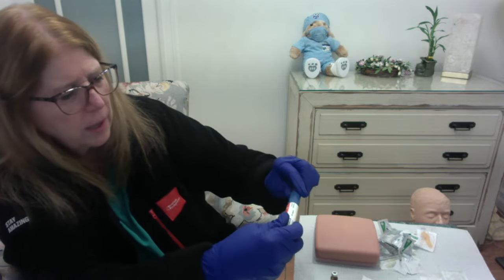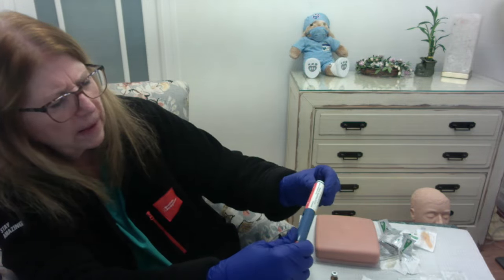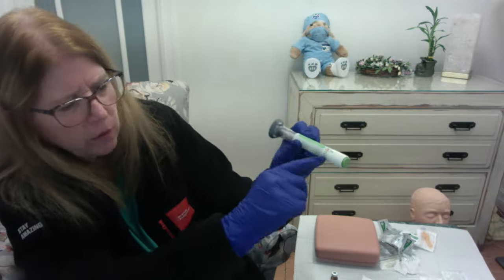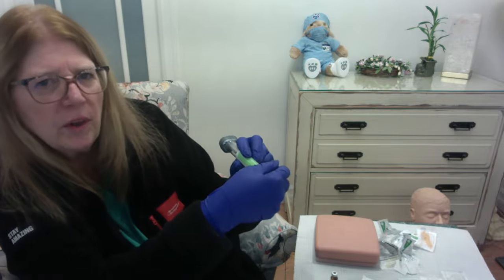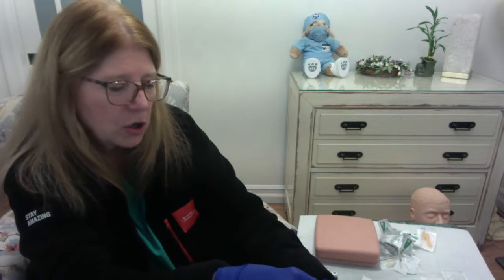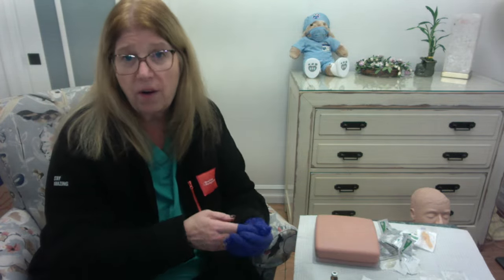And so if we look at this, this is Repatha. I don't have an insulin pen, but I'm going to tell you that there's going to be a dial. So if you had an insulin pen, you literally would dial it up to the number of units that you need, and then you would inject, right, by pushing the button, and that will inject the insulin into the patient. We'll go over these in more depth, certainly in the lab, and have some more show and tell stuff for you that you should find helpful.